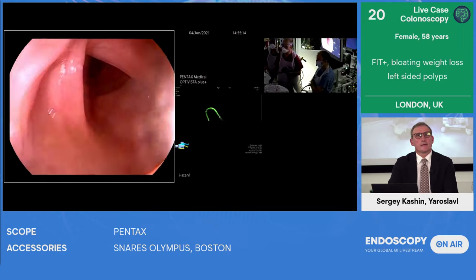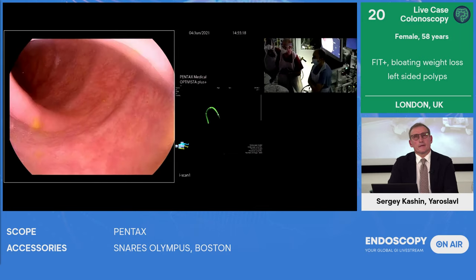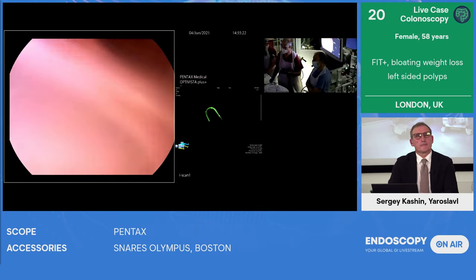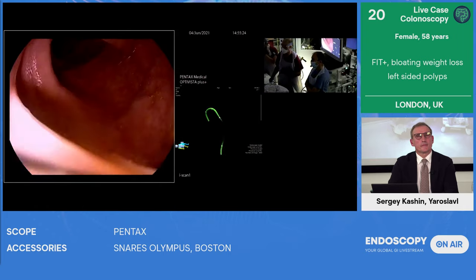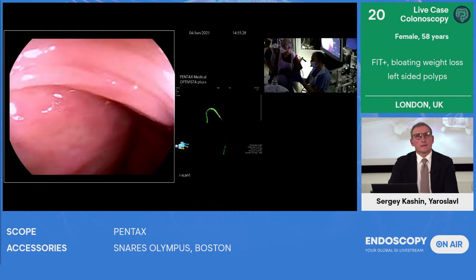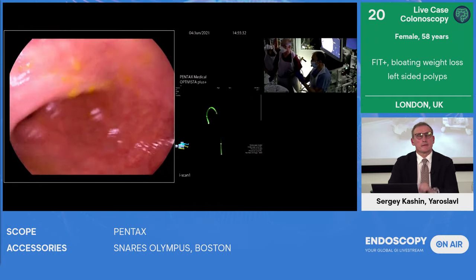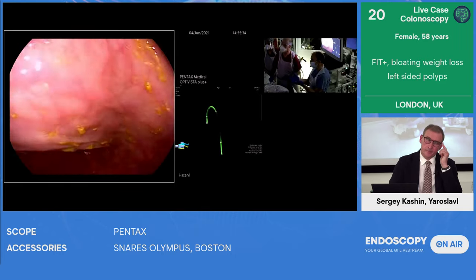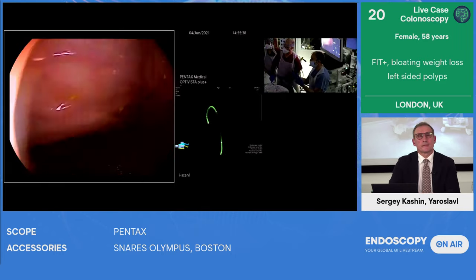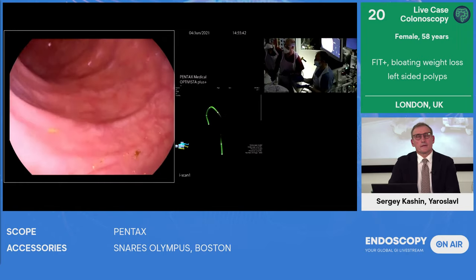And I like this iScan mode with the enhancement. What do you think, Ed? Do you have a preference? I'm a big fan of iScan 1. The focus on surface irregularities is really helpful, because often there are tonal or colour changes to a polyp that catch the eye, and those differences are exacerbated with iScan 1. So I find it enormously helpful.